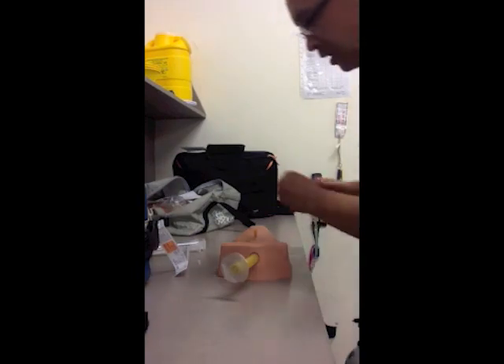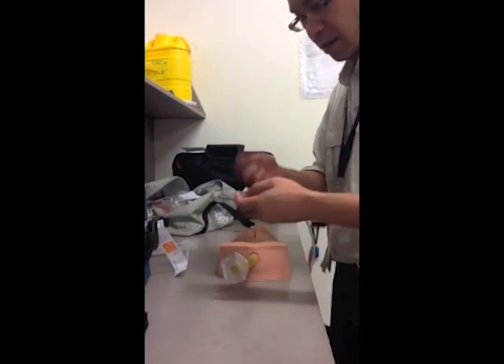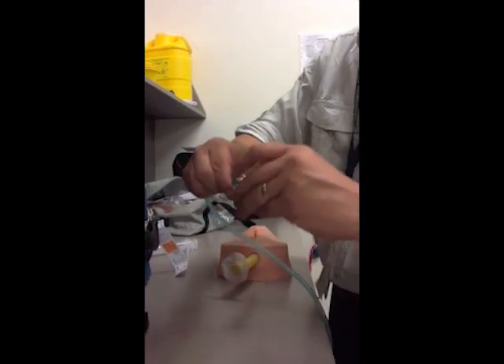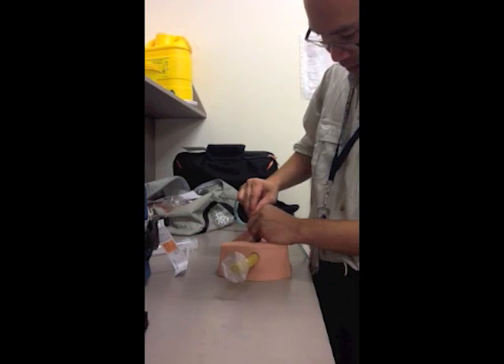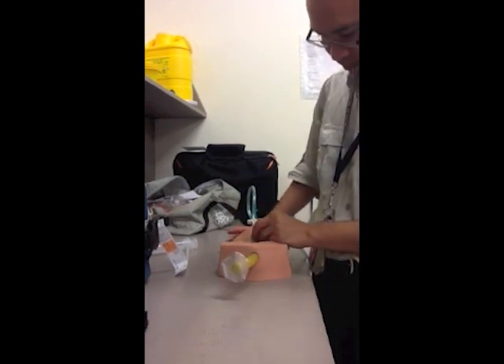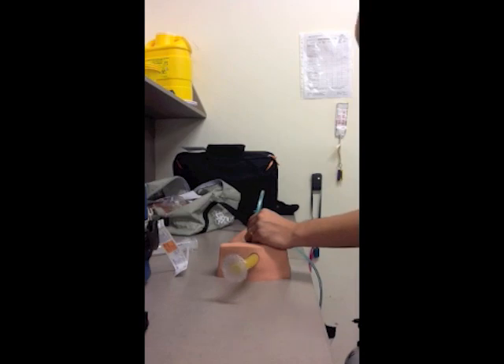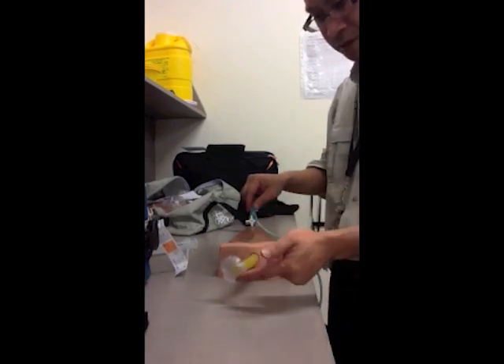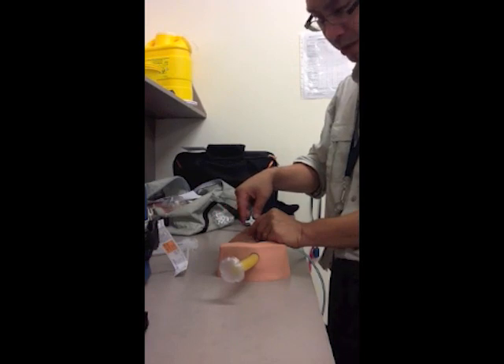Alternatively, I can use a three-way stopcock. I push the proximal end onto the oxygen tubing — it requires a little bit of force. You can see it's on there securely. With the other end, I can securely connect that to the catheter hub. Turn it back on to 10 litres a minute. Without occluding any ports, there's still some oxygen flow into the airway, and as I occlude it I can get more flow and provide more volume of oxygen going in there.